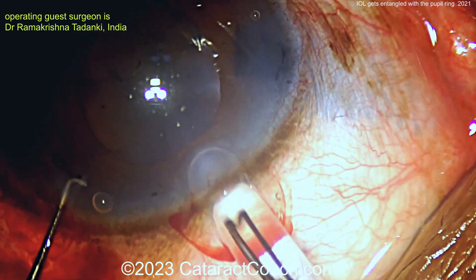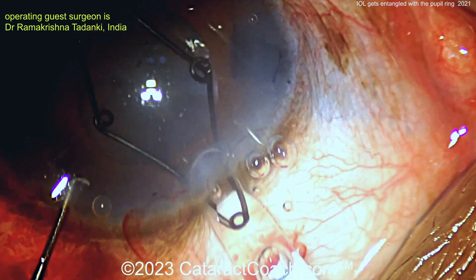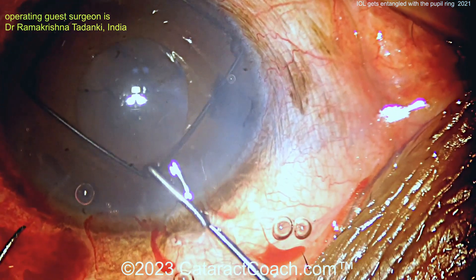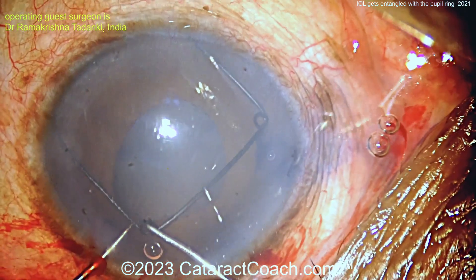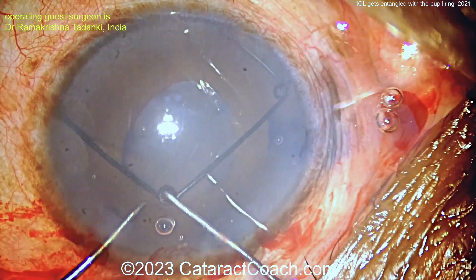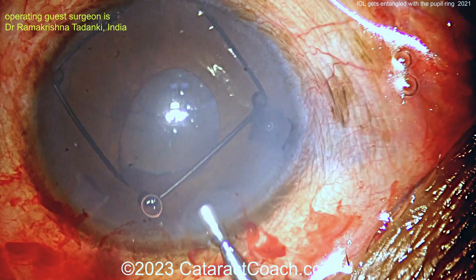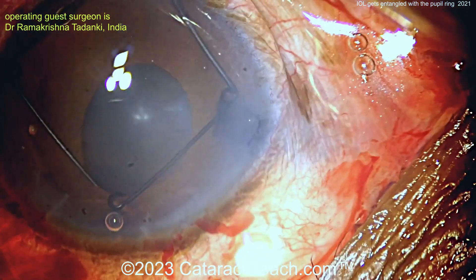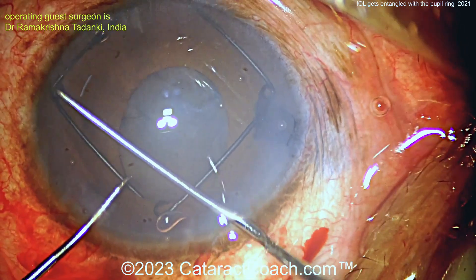We'll cut right to it. Here's implantation of the pupil ring — putting that inside the eye. Looks like perhaps a Malyugin ring or similar device. That's gone inside the eye, getting those four scrolls placed appropriately. Usually when I inject these, I like to actually insert it so that it captures the pupil margin as we're injecting it. You could probably get three out of the four of them just with the injector.